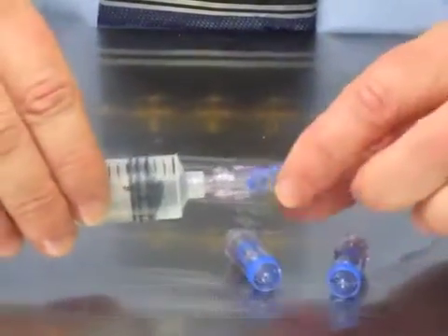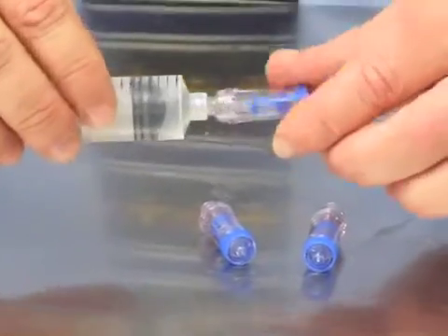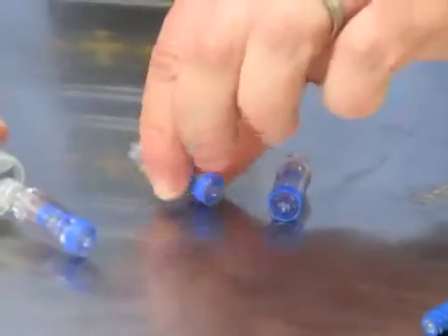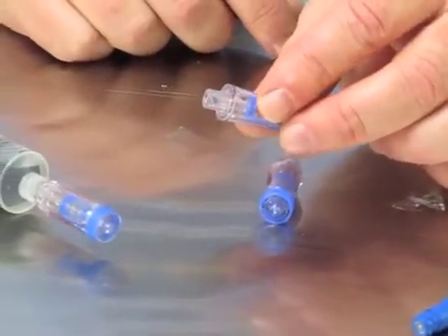The spinning Spiros, once it locks on, has a cracking pressure and you can spin it either way without worrying about accidental disconnect. And then there's a standard Spiros, which just locks on and does not have the spinning feature.